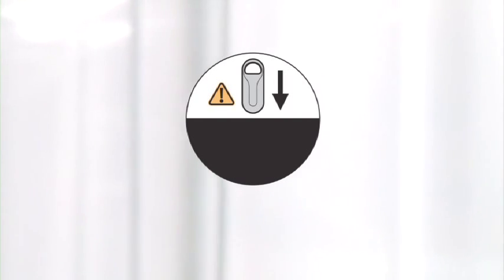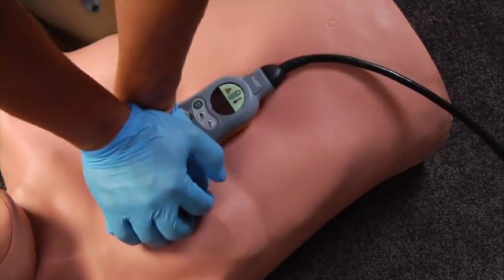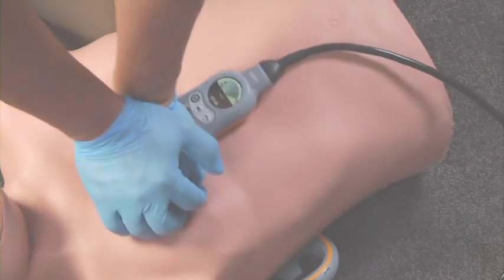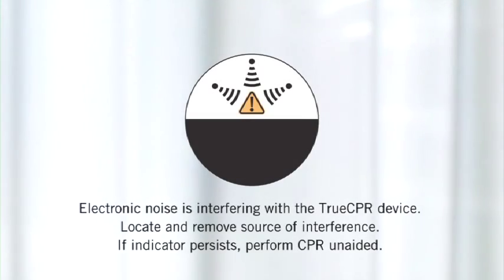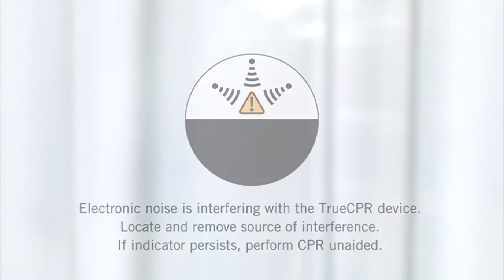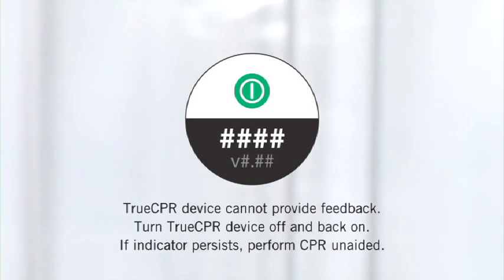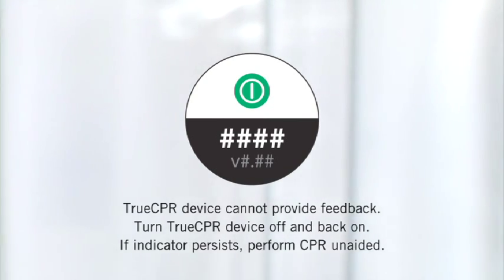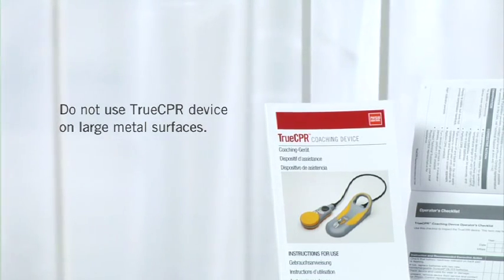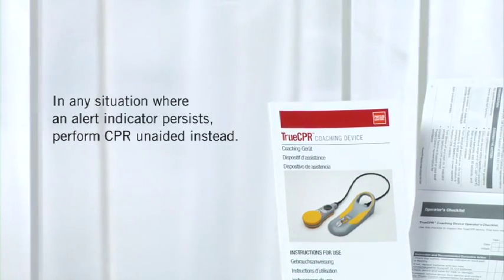If the reposition back-pad alert indicator appears, adjust the back-pad position. If you see the electronic noise symbol, it means electronic noise is interfering with the device — locate and remove the source of the interference. You'll see another alert if the device cannot provide feedback; try turning TrueCPR off and back on again to clear it. Remember, TrueCPR can't be used on large metal surfaces. In any situation where an alert indicator persists, perform CPR unaided instead.